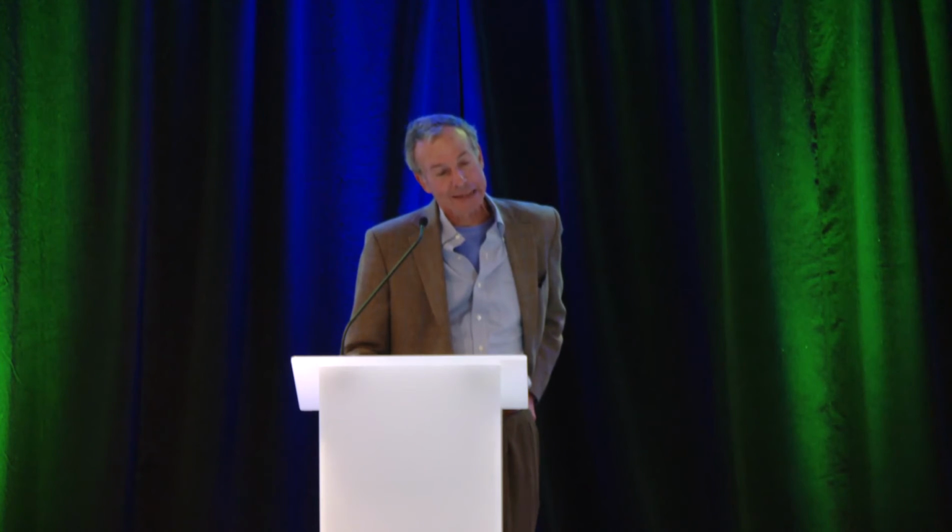So in the beginning, they wanted me to show you really the beginning of manometry. Well, that's it. The first recorded esophageal contraction in man in 1883, where they brilliantly showed that it contracts. And then the first demonstration of peristalsis in man in 1924. That's not all that long ago. And early on, it was kind of recognized that there was an art to manometry and that, yes, you have all of these contraptions, but it's an electronic chain, and you're basically recording a signal, and it's only as good as the weakest component in that chain. And that's true of all electronics, actually.